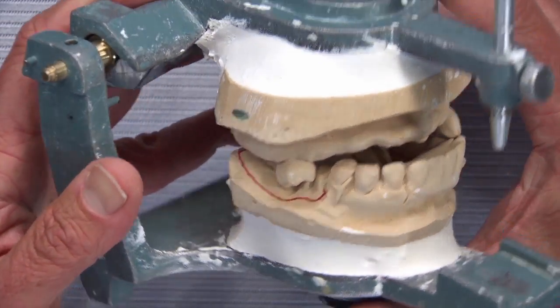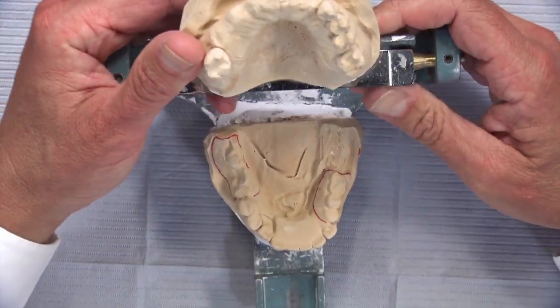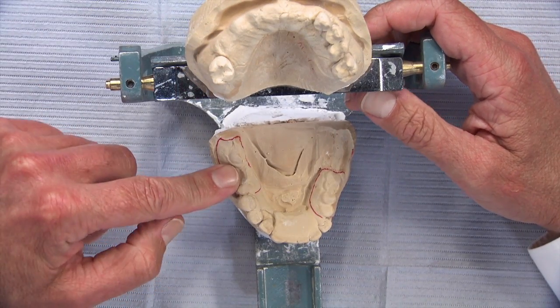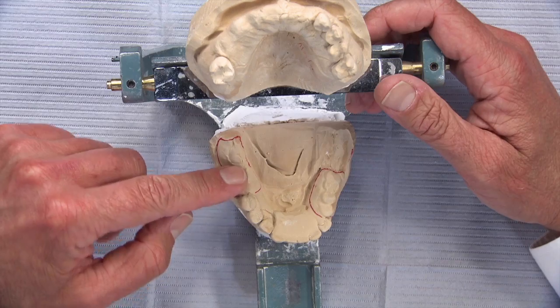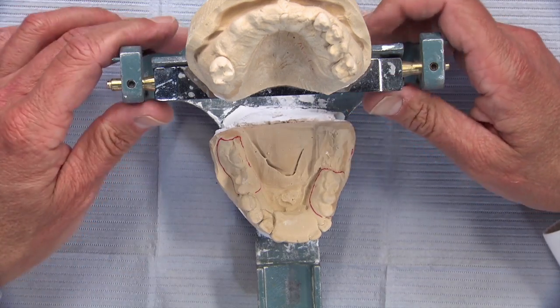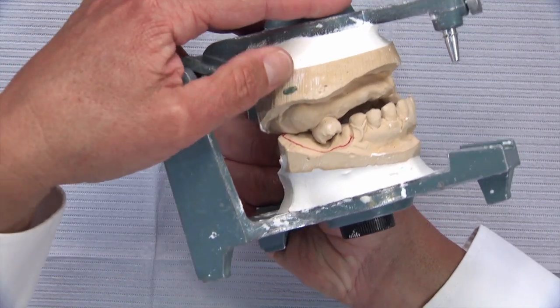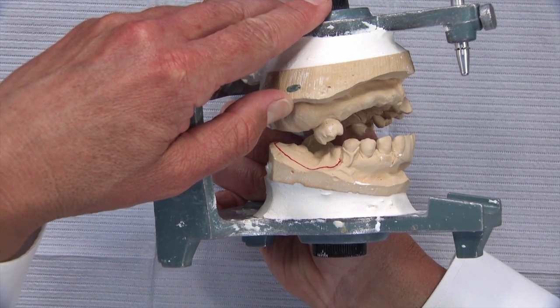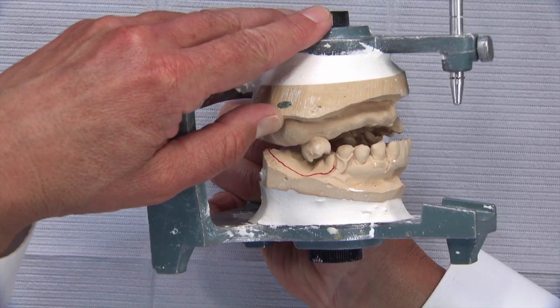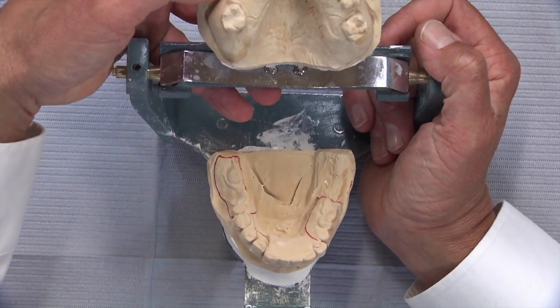And so as we look at it and try to figure out what it is, we see the patient has a lower partial denture, and the acrylic teeth are basically worn down to the mesh at this point. And so you look at this, and that's where this tooth has been hitting, just eating down into that, whereas before it was probably up on a normal occlusal plane, not quite that tilted, but the bite was definitely open before. So there were a couple of different options that were run by the doctor.